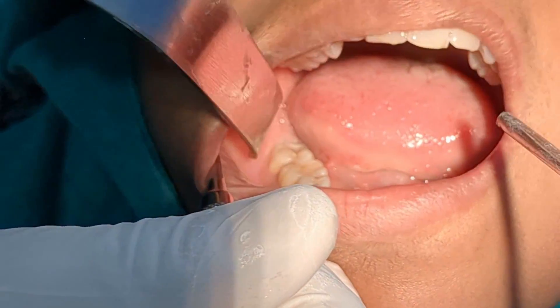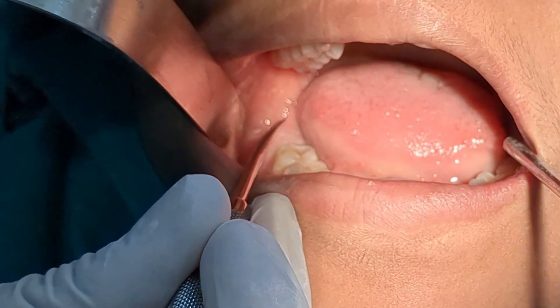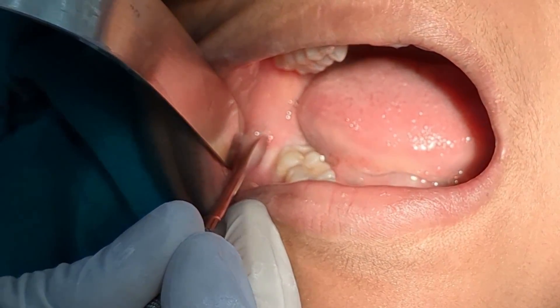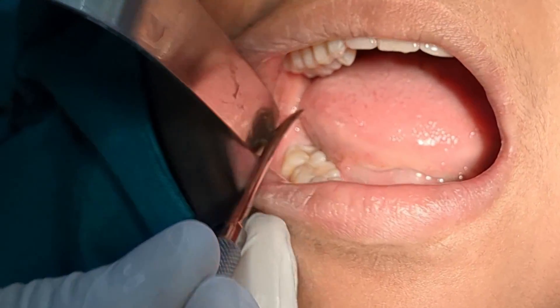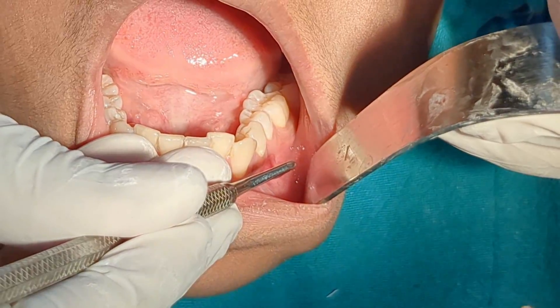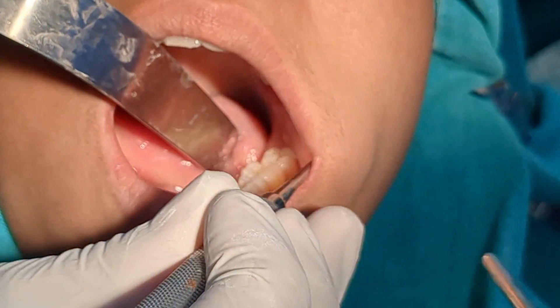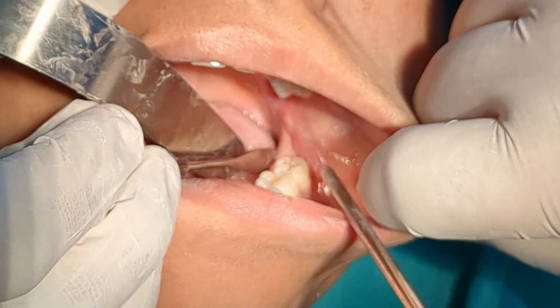I lightly poke the blunt end of the periosteal elevator on the contralateral side so that the patient knows what actual pain feels like. I do this so that the patient can clearly differentiate between pain and pressure experienced during the surgery. I then check for signs of buccal nerve block in the buccal tissue adjacent to the third molar, signs of inferior alveolar nerve block in the region apical to the premolars, and signs of lingual nerve block on the lingual tissue. The patient does not have any pain, as all the blocks have worked fine.